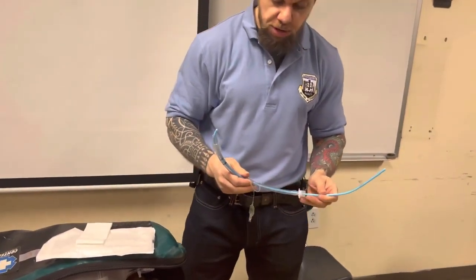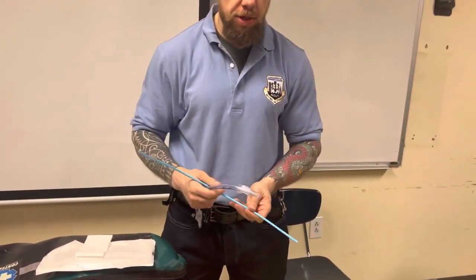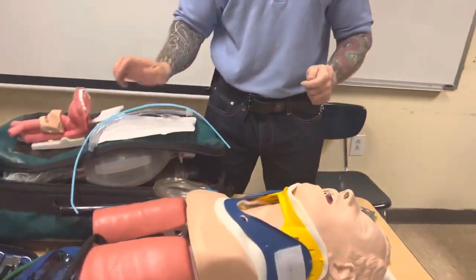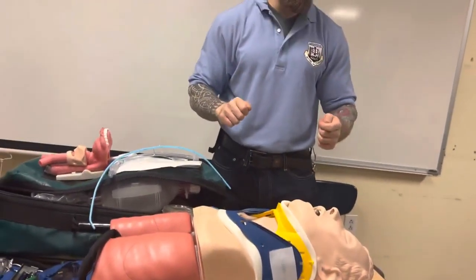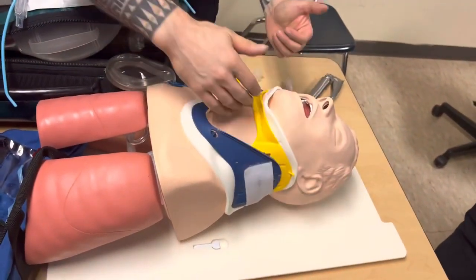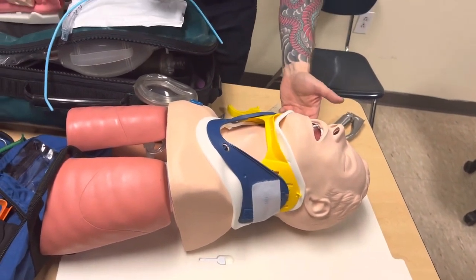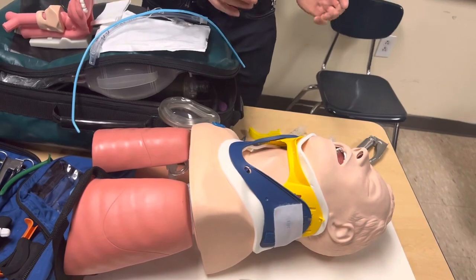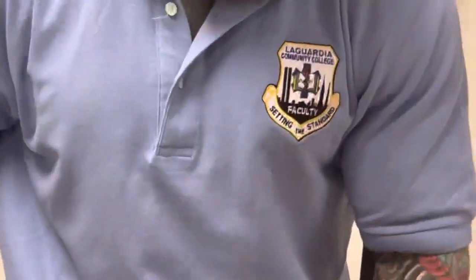How we're going to do this procedure is as follows. We're going to have one person who is my partner, and they're going to perform what's called the ear muff technique. What this means is that once we open the collar, and we need to open it so that the jaw, the mandible, becomes mobile, the partner is going to grab the ears, and their job is essentially not to allow the head to lift off the stretcher or wherever the patient is lying, on the floor. Your job is to hold the ears so the head does not move up. Everybody follow? All right, so this is what we're going to do.